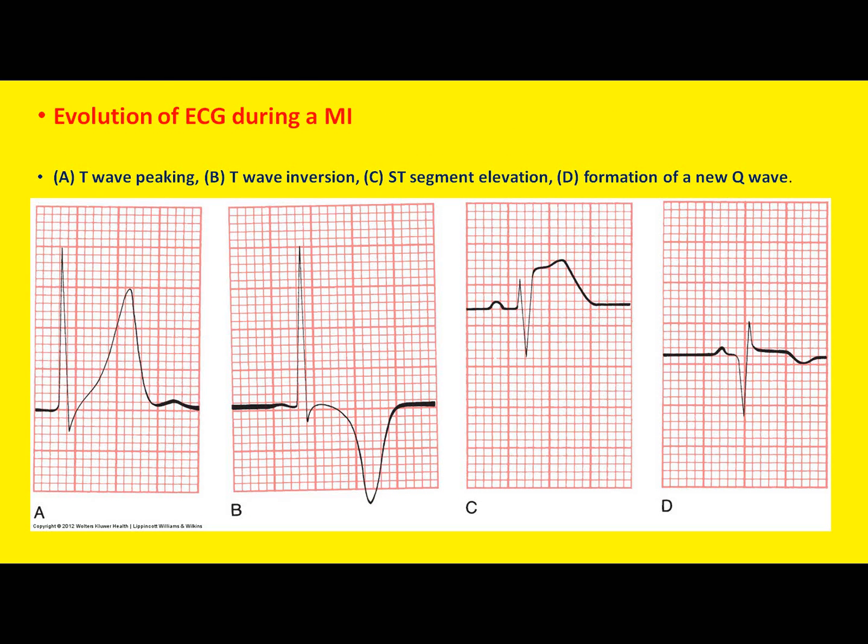See that right here? Here's the ST elevation, and what's this wave? What is it called? Q wave, because it's the first wave which goes down. And see how big that Q wave is compared to that septal one I told you about, which is tiny. Anytime this Q wave is at least 1/3 or more of the size of the R wave, that's how we determine whether it's important or not. If it is less than 1/3, we consider it as septal, not necessary.